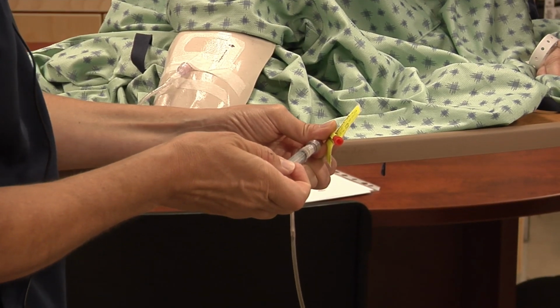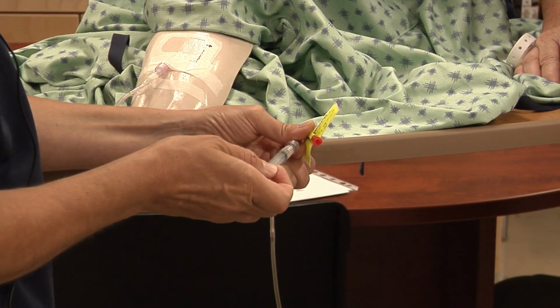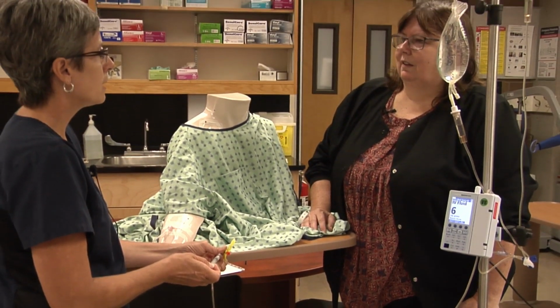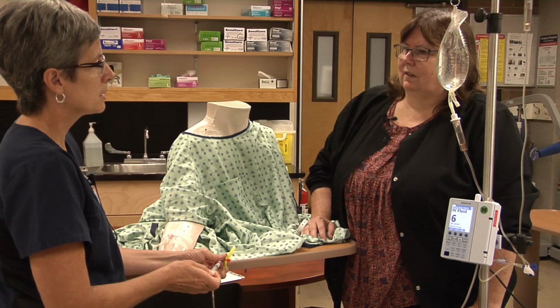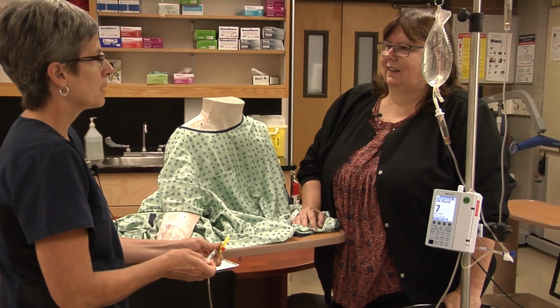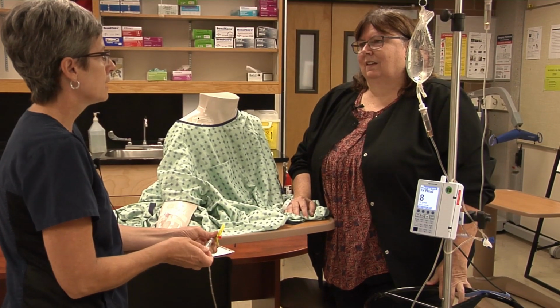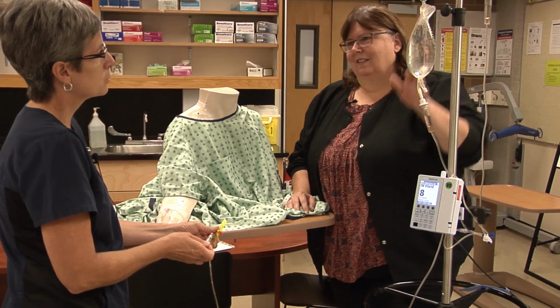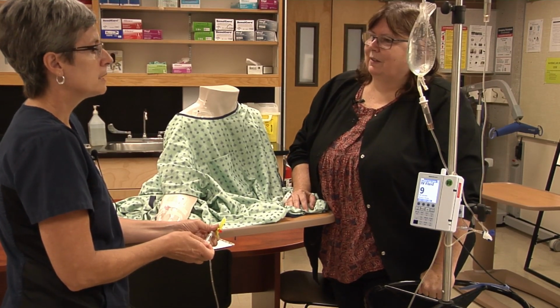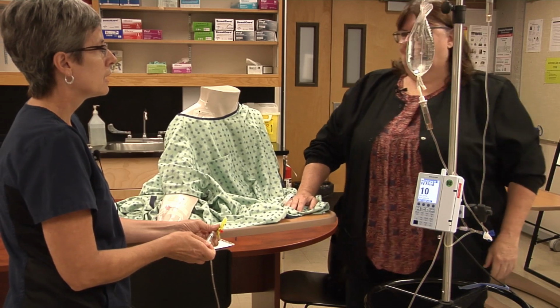Now I've seen some nurses, instead of using the bolus feature, just increase the rate. Yep, you could do that. The good thing about the bolus feature is when the bolus is done, it will go back to the original rate. If you just increase the rate, which isn't wrong, but you forget to come back, then the patient could receive a bolus. Yes. Like the whole thing. Yep. So it's a safety thing. You should be using the bolus.